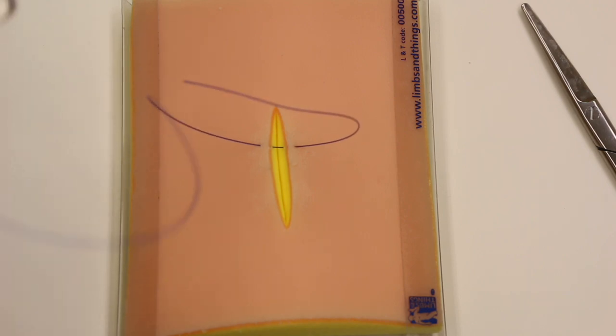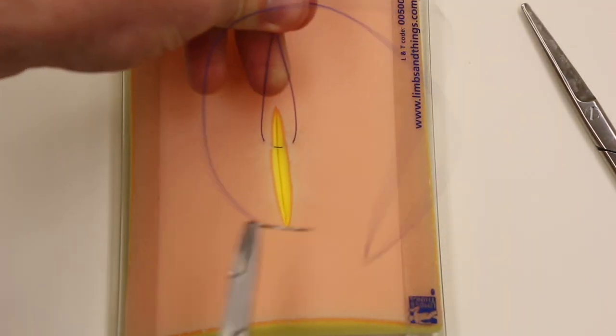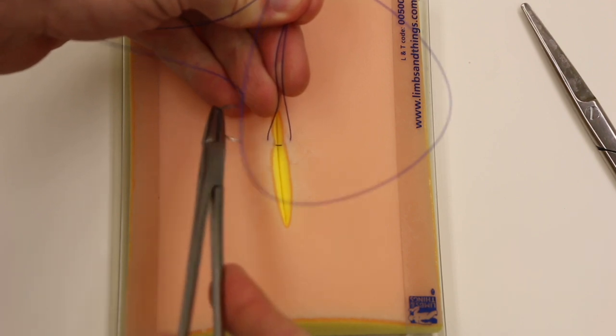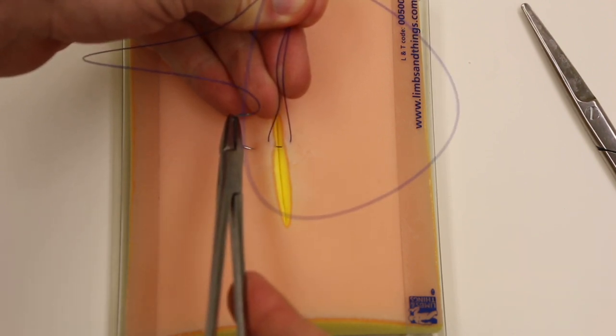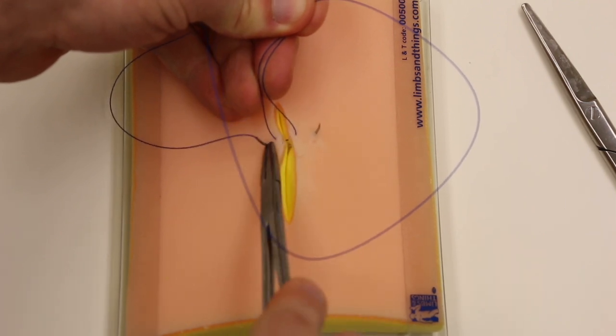And then reload your needle headed the opposite direction that you started. Right here it can be helpful to grab your suture ends, get that out of the way, and then entering just stacked back from that. Going in, crossing, you can see it there, coming out.